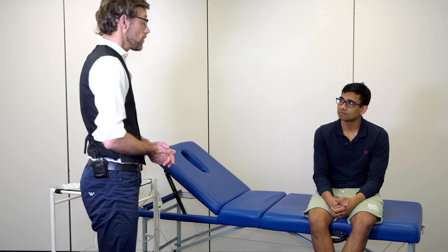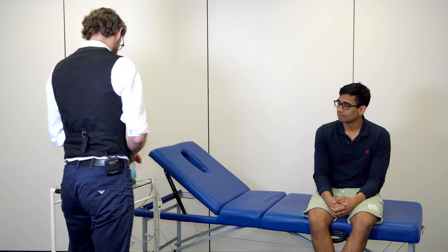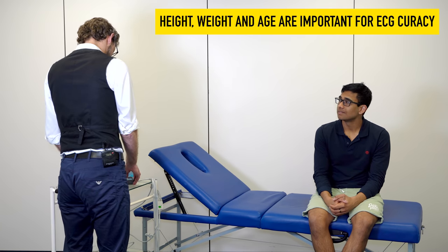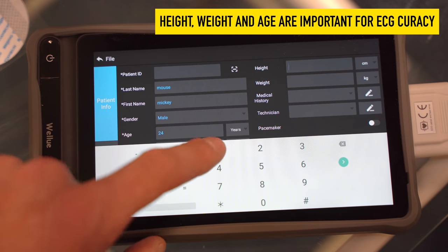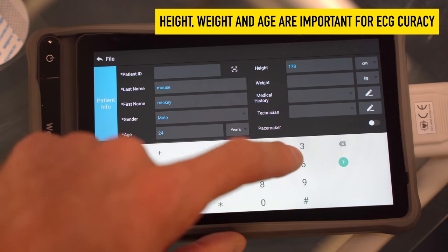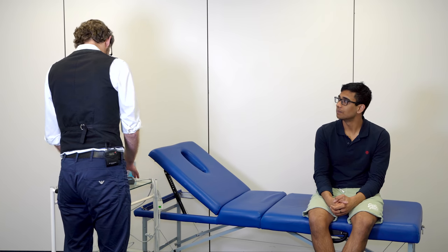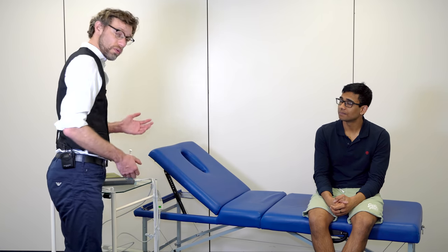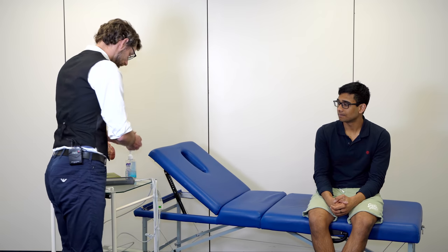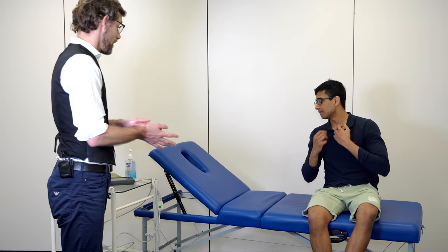I'm going to input that information into the ECG, but I also need your height if you know it. 178 centimetres. Perfect. And your weight? 65 kilograms. And your age? 24. Once we've imported the information, we need to make sure that we're gelling our hands, and if you could please take off your shirt and lie back on the bed.